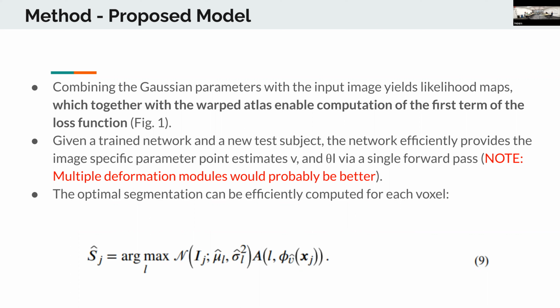You still need to multiply the prior, right? Yeah, but I'm saying you wouldn't need to sample at all. Instead of outputting a mean and average, you can just have your CNN output a 3D confidence interval. You now have some confidence interval for each of the voxels, because you have a sigma. If your sigma is super small, you have a lot of confidence that this is the exact value of that voxel.